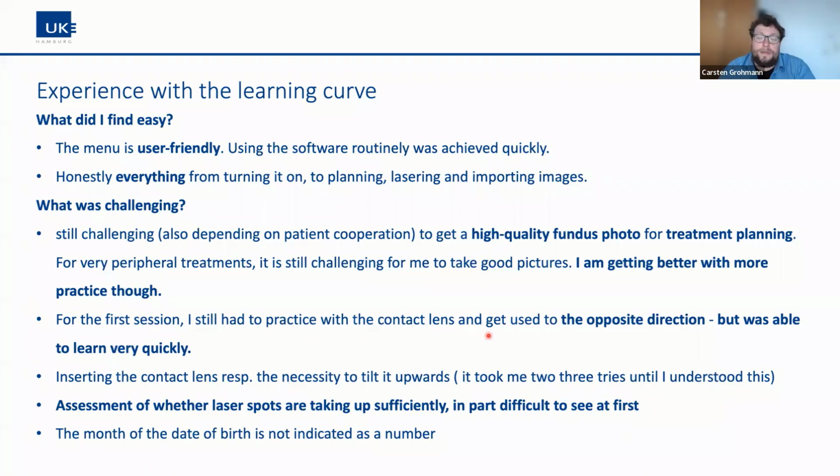It's very important that you're familiar with using a contact glass, probably the Goldmann contact glass, in examination of the patients, because you will use a PRP 165 or a Superquad or something else on your patient for the central treatments and the panretinal treatments, and for retinal tears outside or specific central treatments, you will use the non-contact lenses from the Navilas laser.